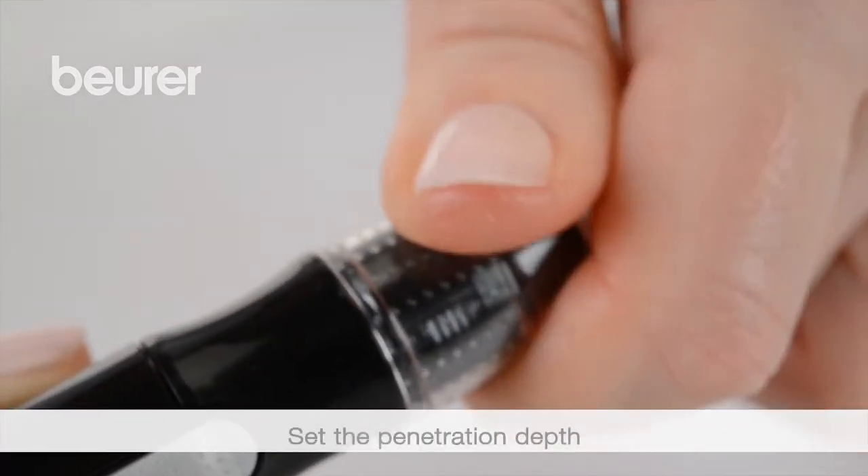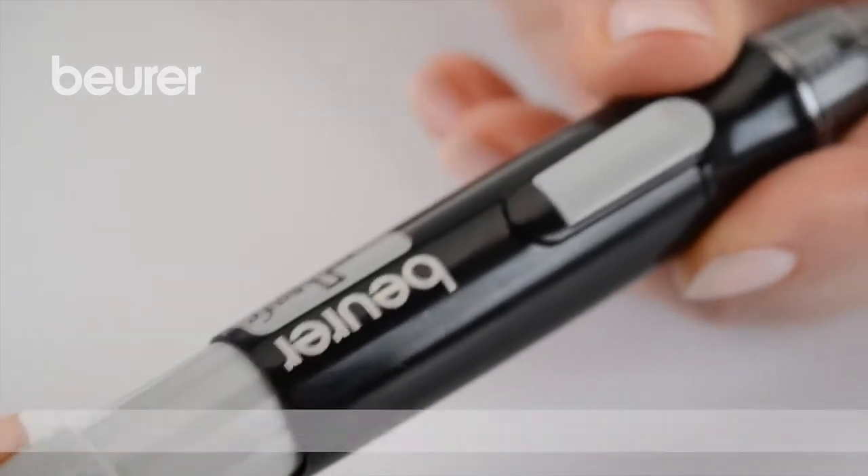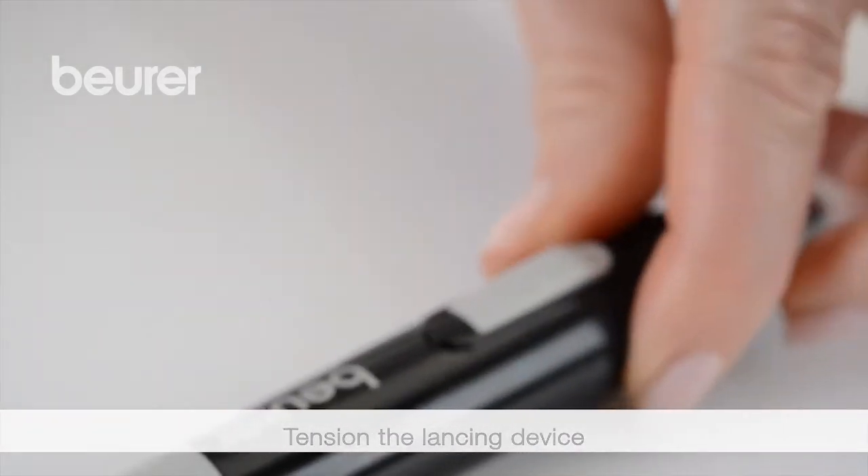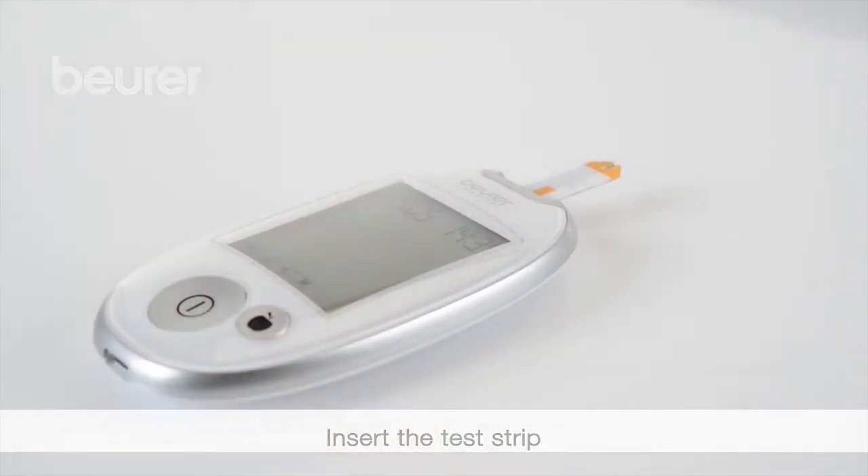Set the insertion depth by rotating the upper moving part of the cap. Tighten the lancing device. Insert a test strip into the device with the contacts first.